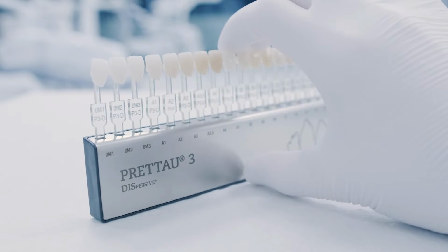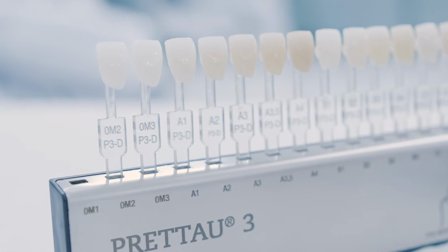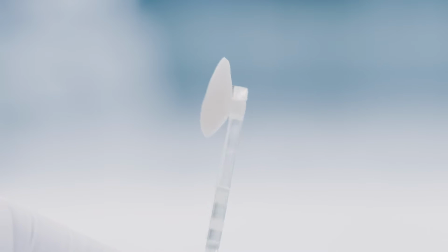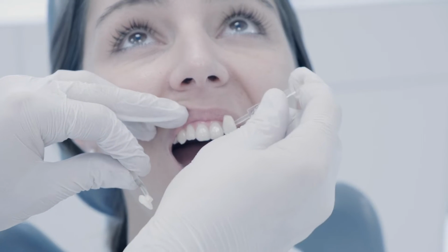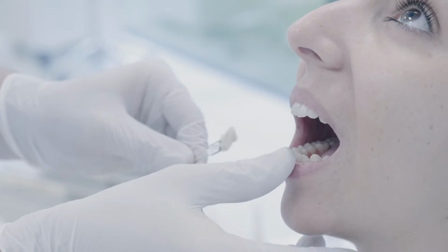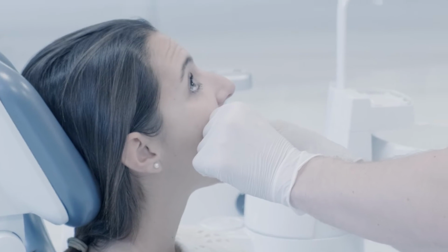The color spectrum is inspired by the Vita Classic range and comprises 16 dentine shades and 3 bleach shades. The sample teeth are monolithic and glazed with 3D base glaze. Hold the shade guide in the shape of an upper incisor against the natural teeth to determine the natural tooth shade for a monolithic upper jaw structure to be fabricated in Prettau dispersive zirconia, or to check the interplay with the natural residual teeth or already fabricated zirconia lower jaw structure.